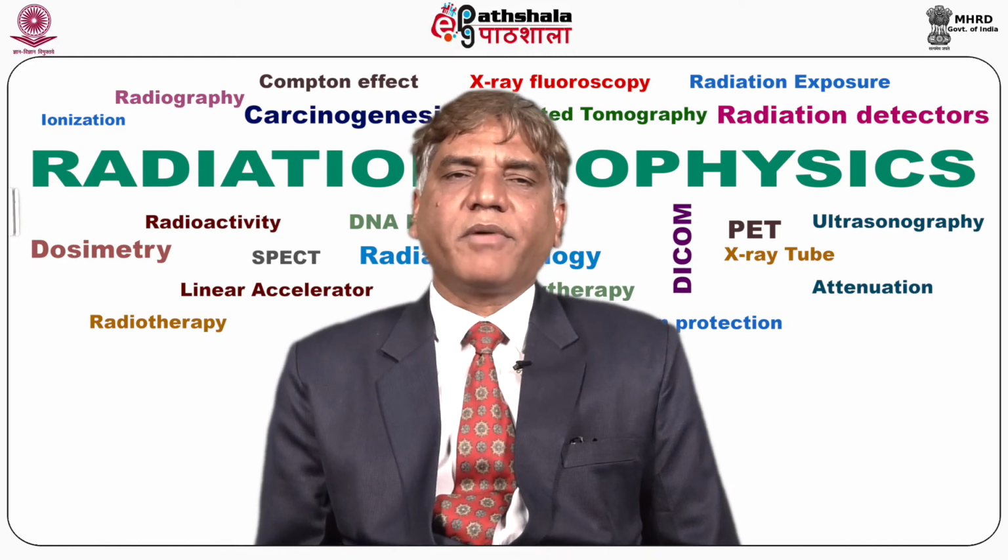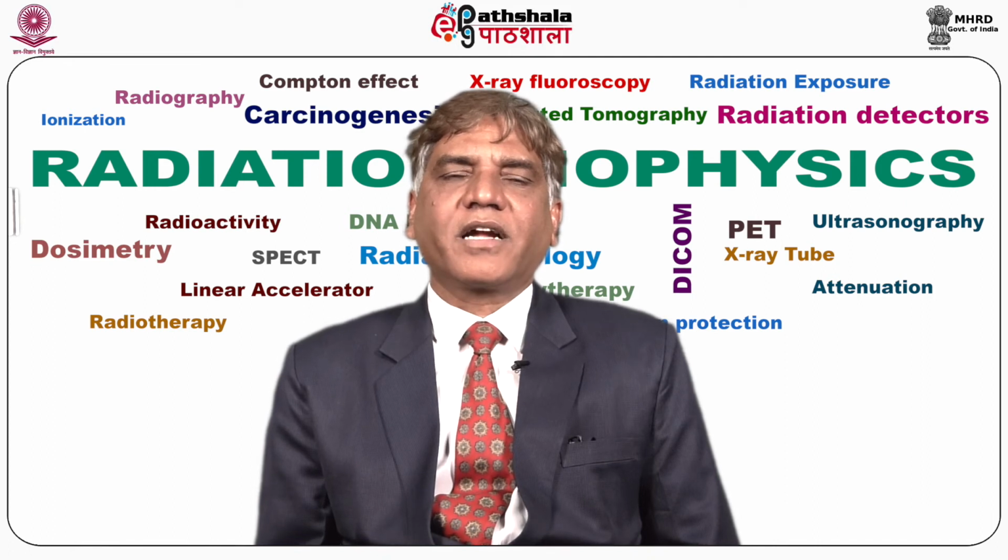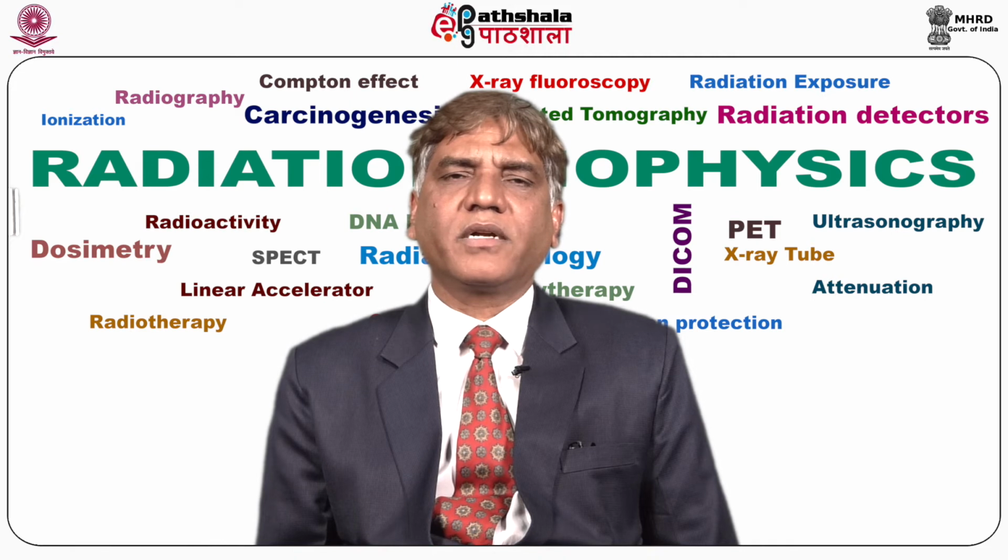Projections are modified by introducing negative functions so that when back projection is performed, the negative values cancel out the image except at the appropriate location. The next analytical function is Fourier analysis. Of course, it is not used in CT.